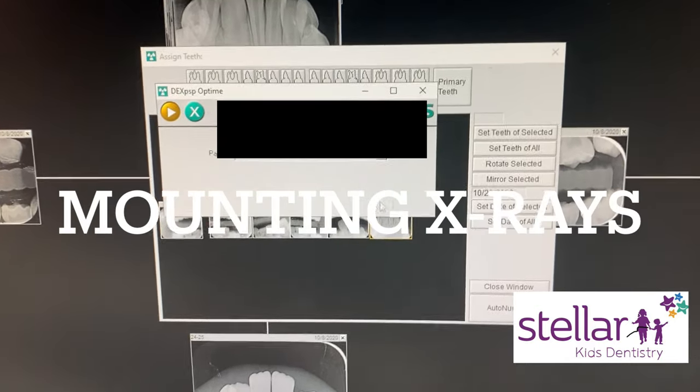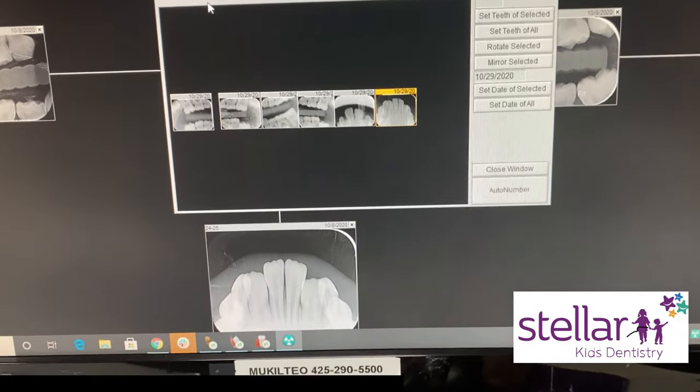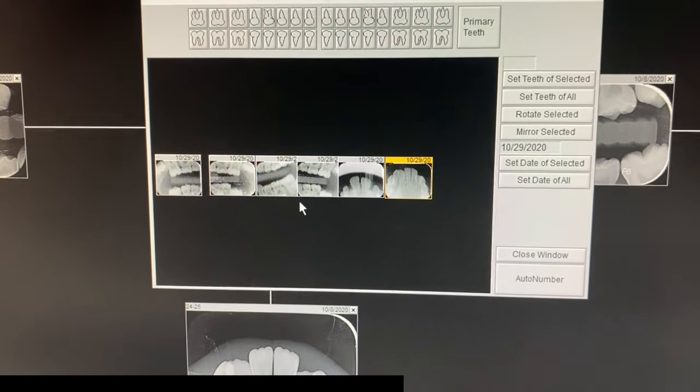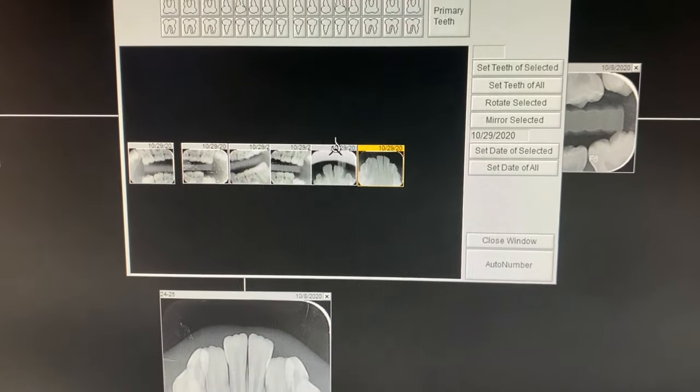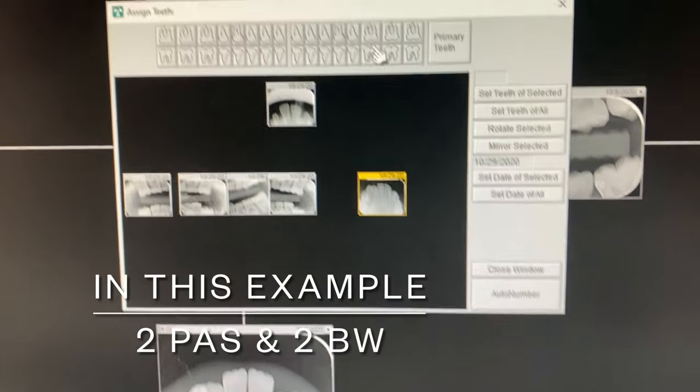I'm going to show you how to mount X-rays. We just did four bitewings and two PAs for this patient. For the upper PA, you'll notice there's a grid up here.